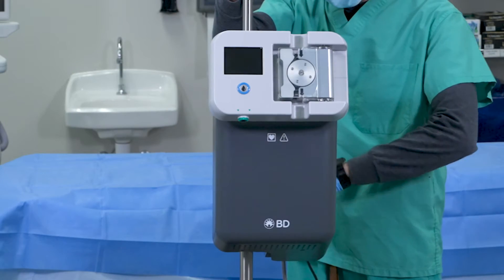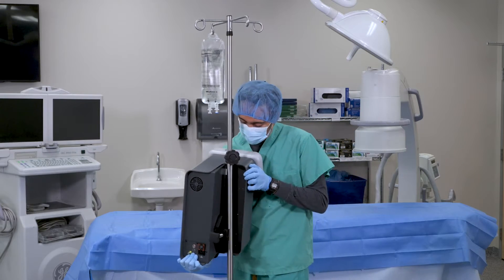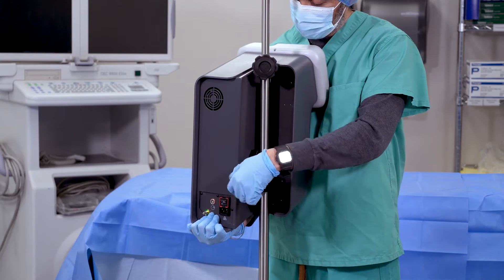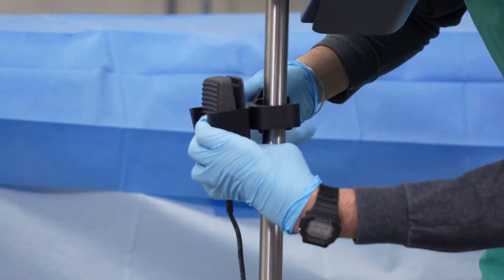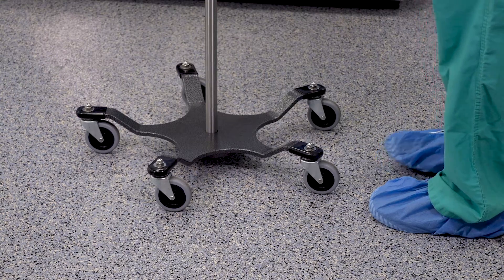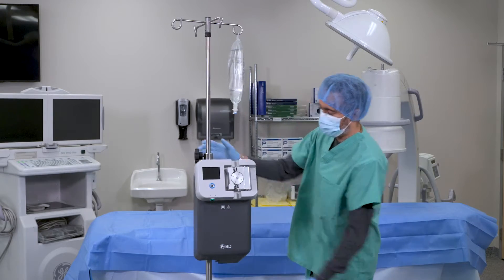Let's begin with setting up the BD recanalization system. Remove the BD recanalization system console, footswitch, and power cord from its storage container and mount the console on a 5-caster IV pole no more than 48 inches or 122 centimeters above the ground.